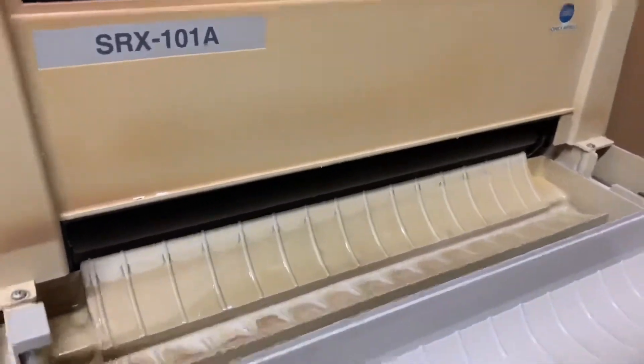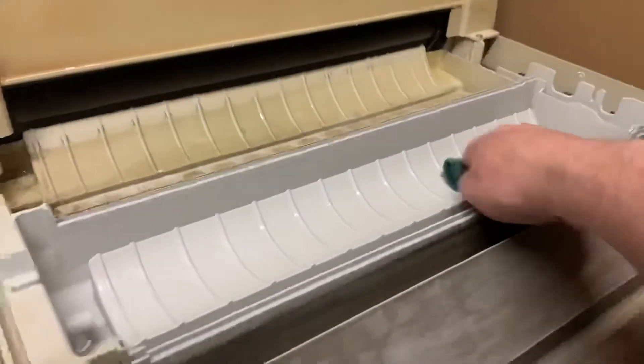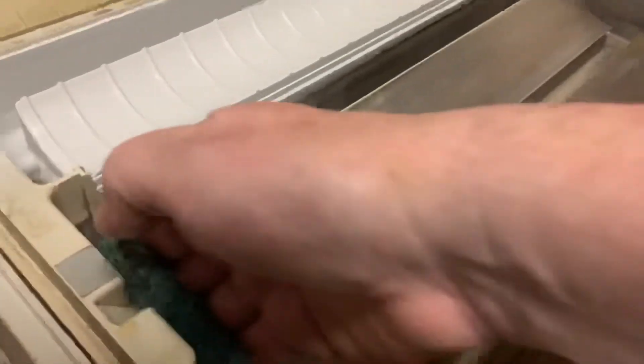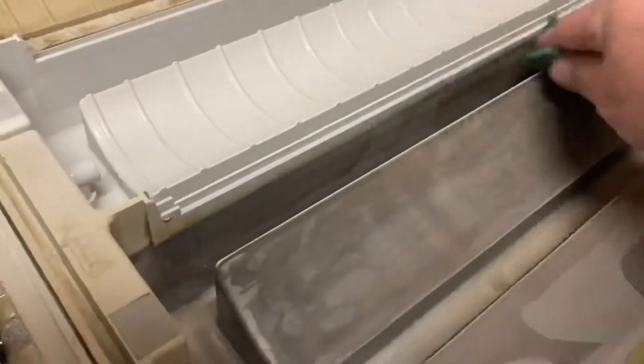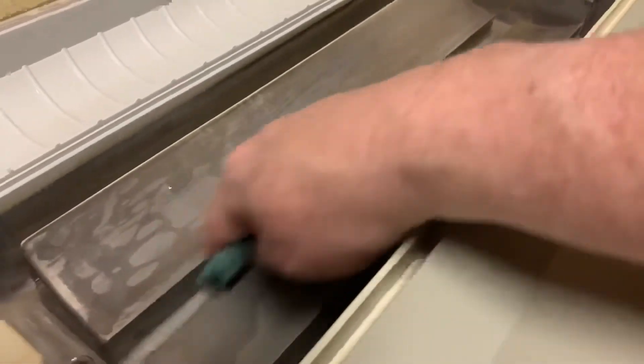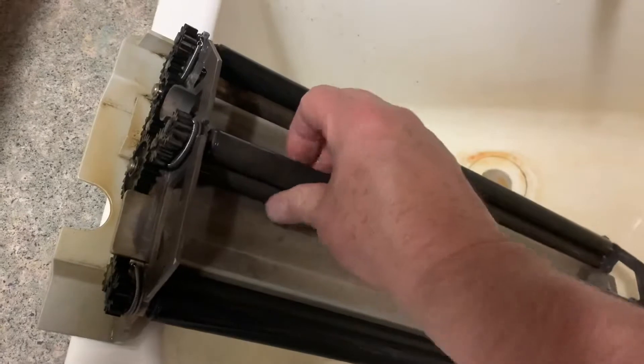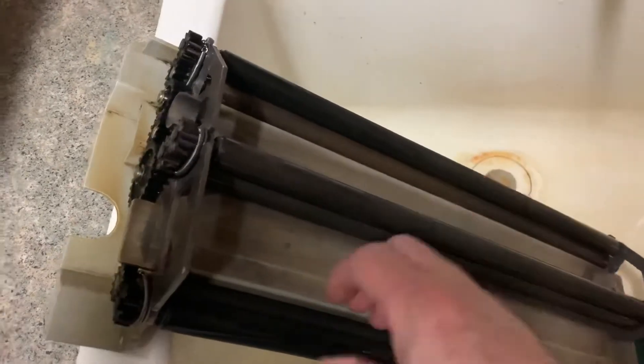During the process of cleaning and preventive maintenance, we'll drain all the old chemicals from your processor and clean the inside tanks thoroughly. On your roller racks, we'll inspect the rollers, gears, springs, and other moving parts to make sure that everything is in proper working order.